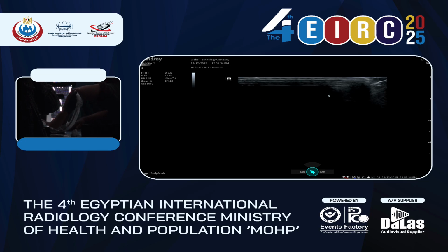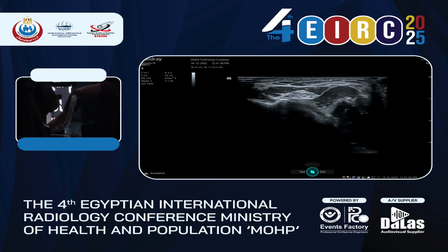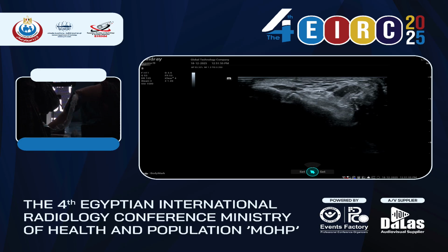We ask the patient to put his hand down like that to stabilize. And when we move down, we see our nerve between the two heads of the flexor carpi ulnaris. So that's the nerve. We see the honeycomb structure, and we have the two heads of the flexor carpi ulnaris. On top of the nerve, there is this hyperechoic, linear structure. This is called the arcuate ligament.